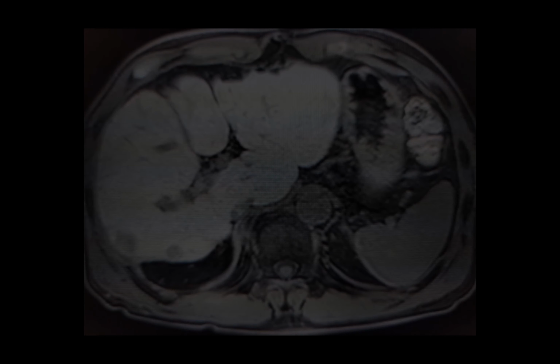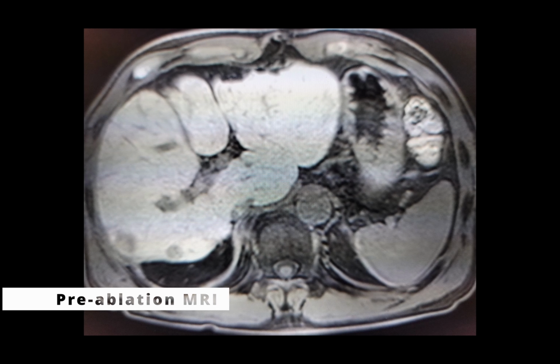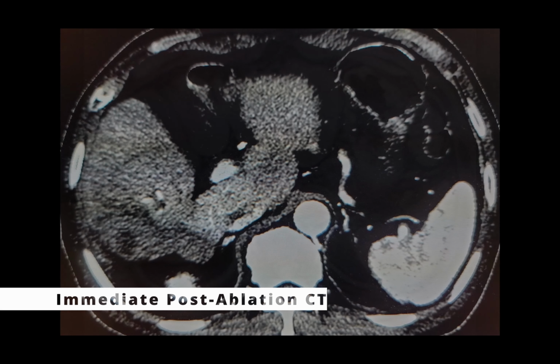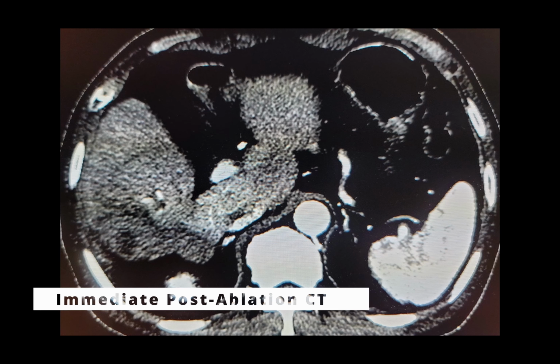Usually it is absorbed automatically. Observe the pre- and immediate post-ablation images. You can see really enough ablation. I think a little bit excessive, but anyway.